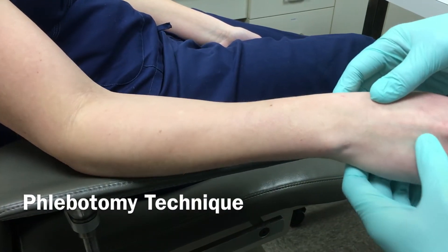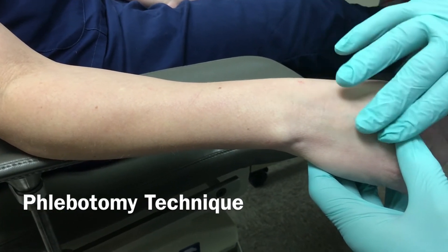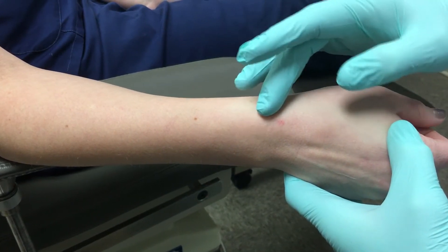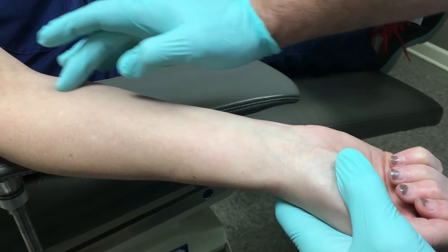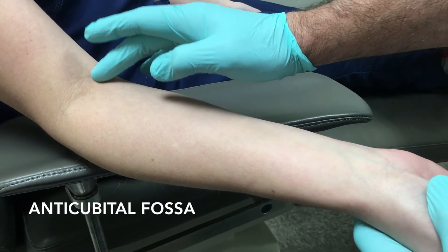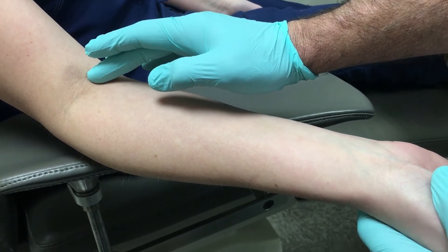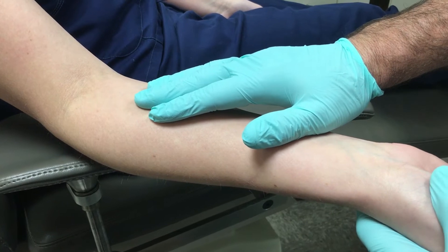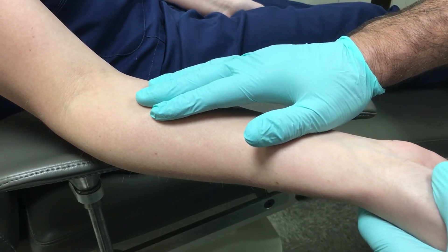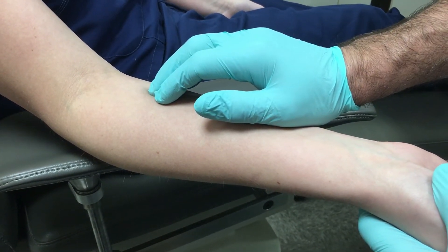When doing phlebotomy, the first thing you're looking for is where to get access. You can look at the back of the hand — the dorsum of the hand is one place. Sometimes you can go to the wrist. The forearm veins are pretty straight. But my preference is to go up to the antecubital fossa. This is usually the best place to get the biggest vein, and that's what I focus on traditionally. You get more comfortable with it and can access smaller veins, but if you're just starting out, look in the AC and see if there's something available.